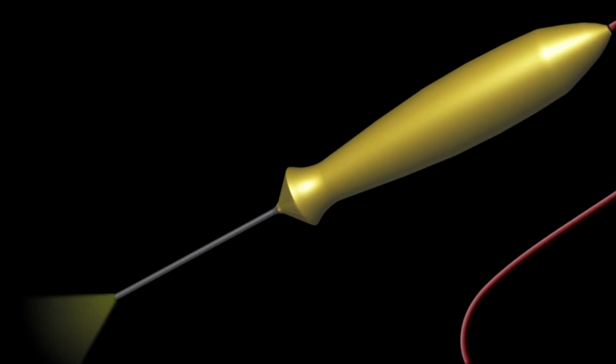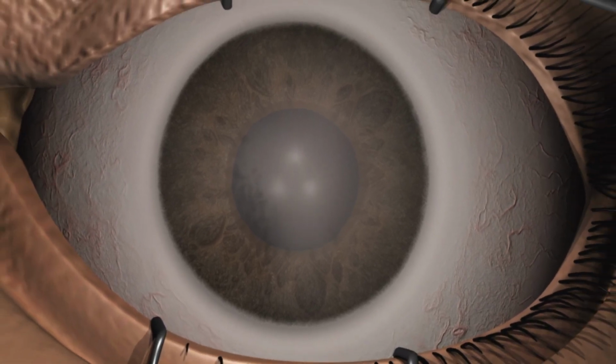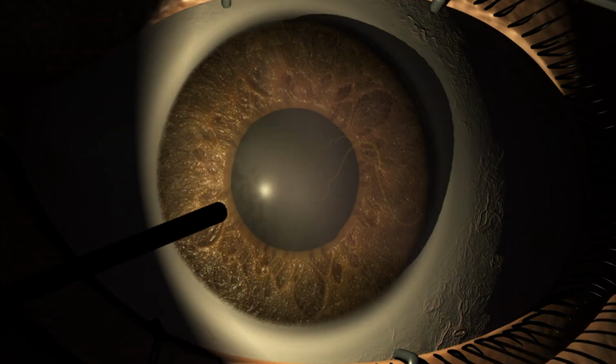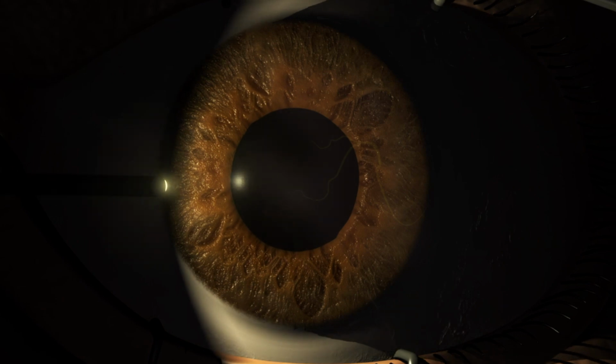ENDOILLUMINATOR works on the principle of oblique illumination, wherein the eye is directly seen under the microscope with the light of the microscope switched off and the ENDOILLUMINATOR being held at an angle of more than 70 degrees externally along the limbus to illuminate the anterior segment structures.